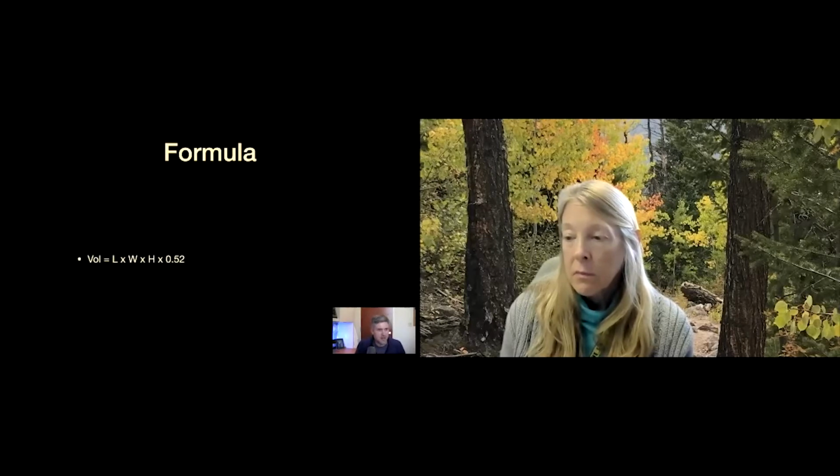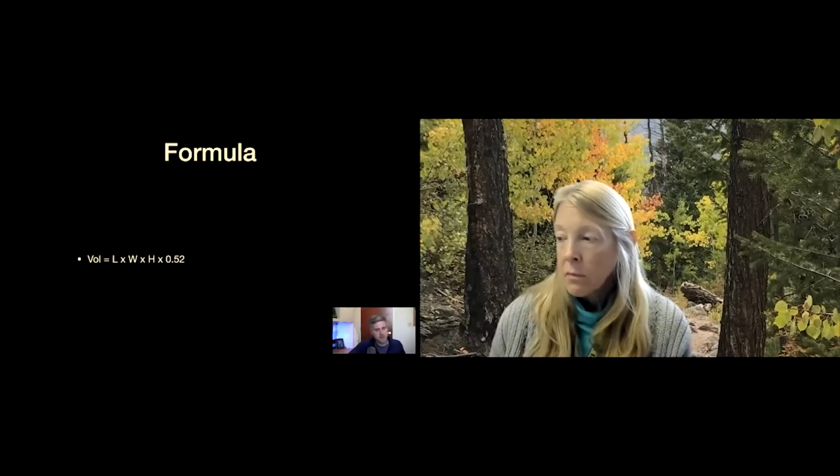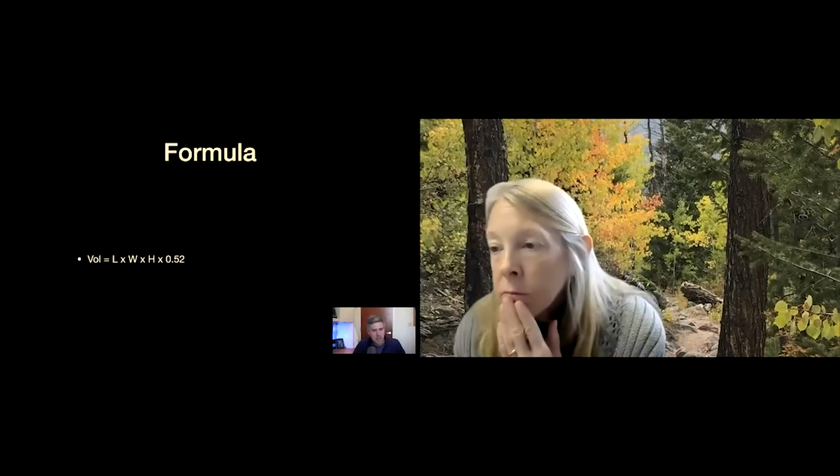And it all goes into this formula, which there'll be a test on in about 10 minutes, just kidding. It goes into this formula, which the machine actually has embedded into its memory, and you can plug these different dimensions in and it'll spit out a bladder volume for you. So your volume is going to be roughly equal to the length times the width times the height times a cofactor, in this situation about 0.52. And you can get that measurement of bladder volume.